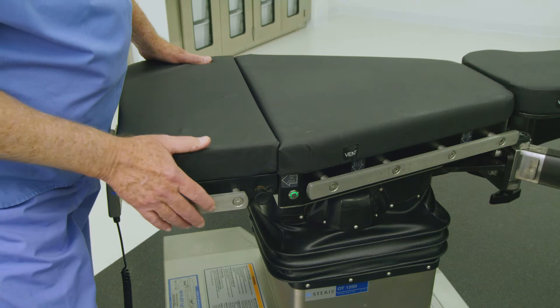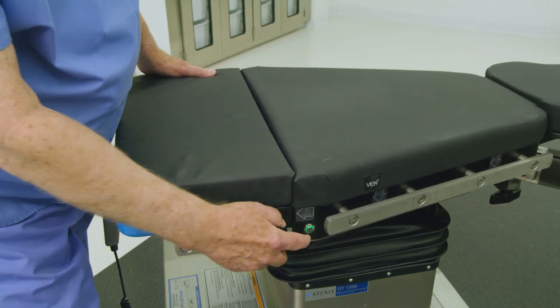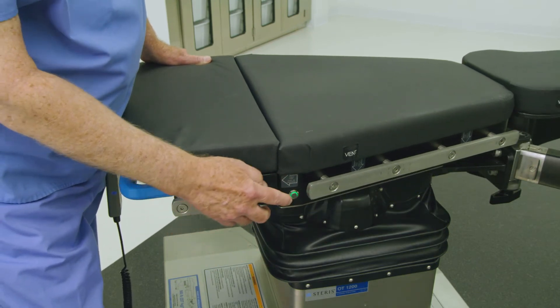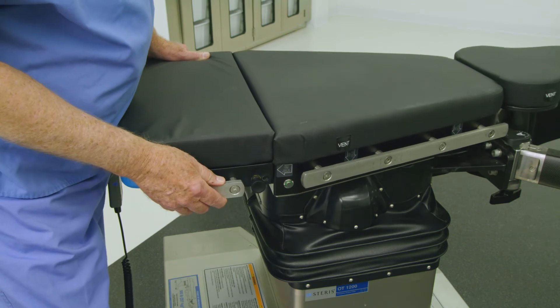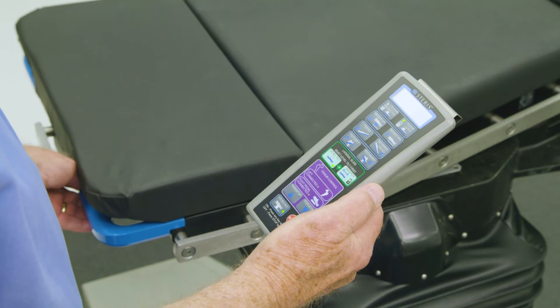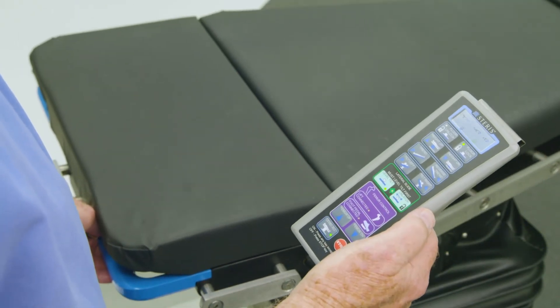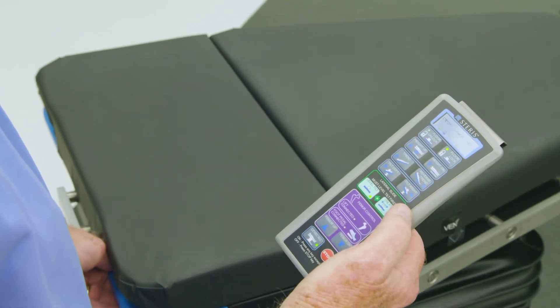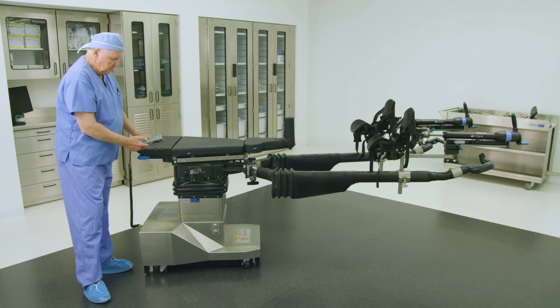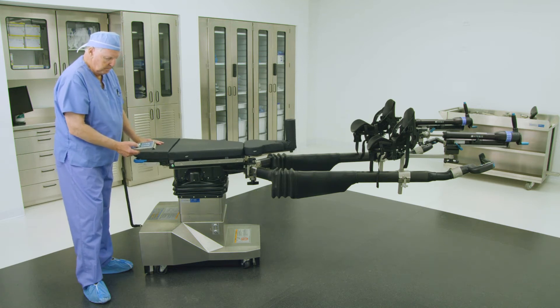The preferred method to translate the tabletop is through the illuminated buttons on the side of the tabletop. Press and hold the manual green unlatch button located on either side of the tabletop, and then physically push the tabletop laterally left or right until it locks in position. Alternatively, the tabletop can be translated by unlatching the lateral slide through the buttons on the primary hand control. Press and hold the green unlatch button on the hand control, and then physically push the tabletop laterally left or right until it locks in position.